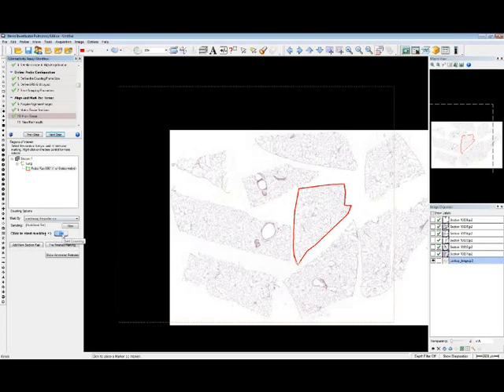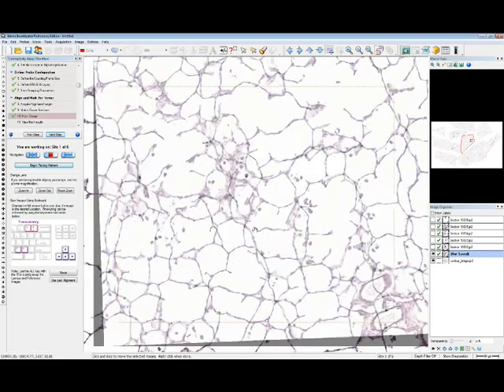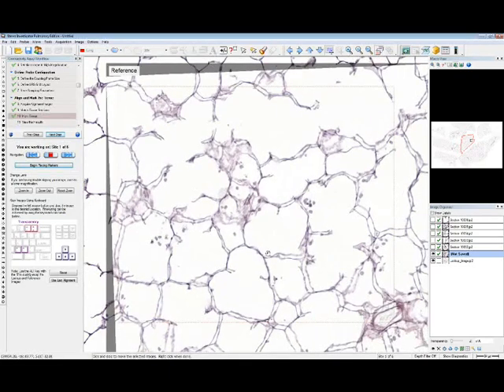And right now, we have an option of going to our probe run here. I can go ahead and start marking. And you will now see that I have an outline of 2 structures here. So I can go in and actually manually move the image, reference, and lookup until they line up pretty well.